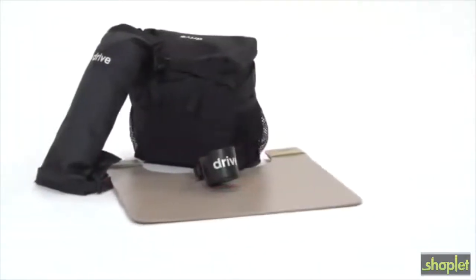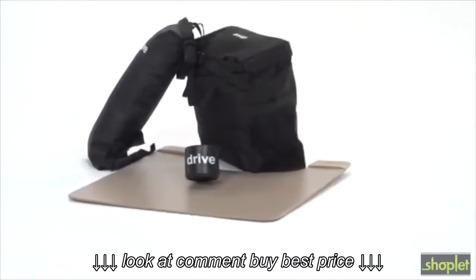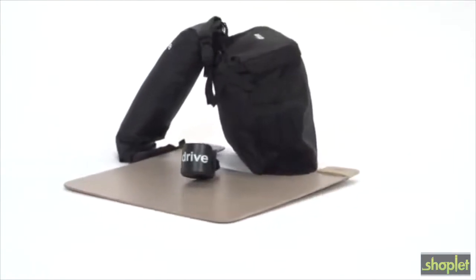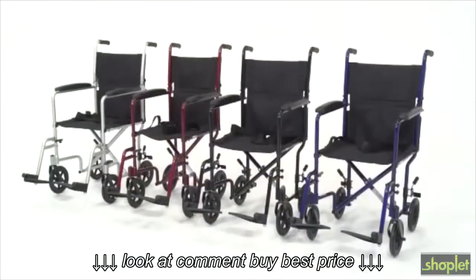Users also gain added convenience from a wide array of accessories, including a cup holder, tray, oxygen tank carry bag, and carry pouches. The chair is also available in four attractive color options.